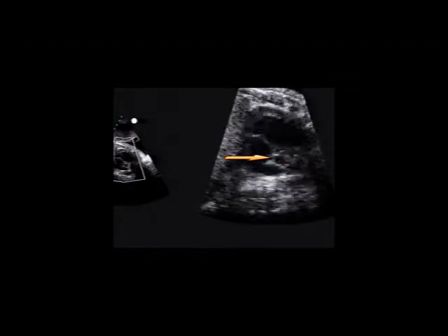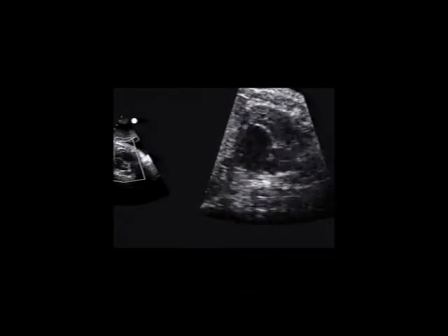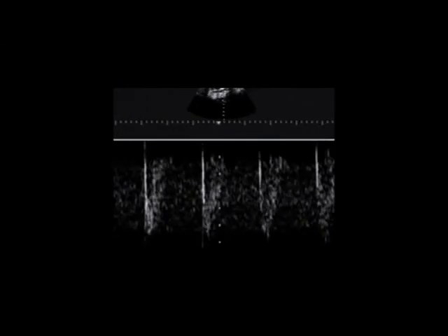В сечениях по короткой оси мы видим нормальную аорту и нормальную лёгочную артерию. В лёгочной артерии регистрируется ламинарный спектр кровотока.